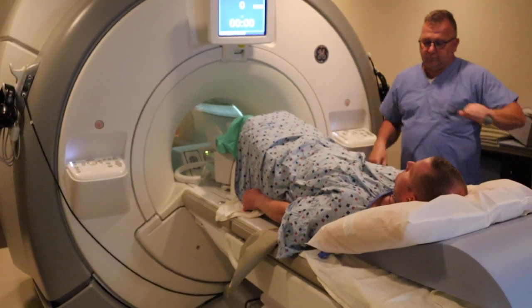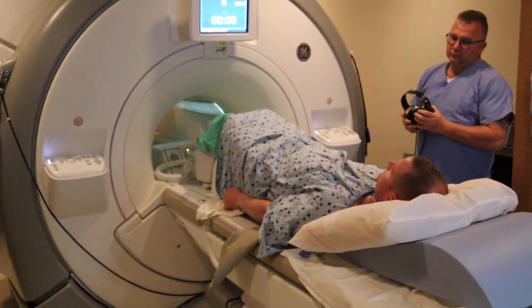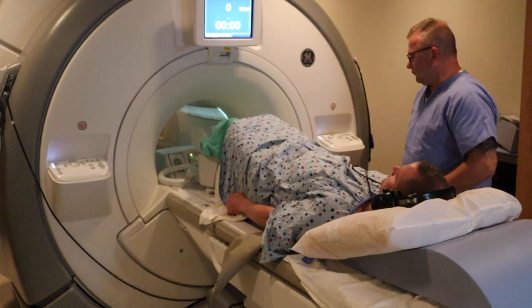We're going to provide them the panic ball in case they need to communicate with the technologist, and a pair of headphones to listen to music provided by the imaging center.